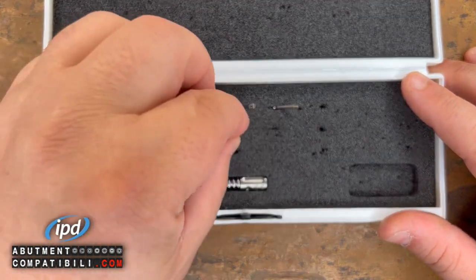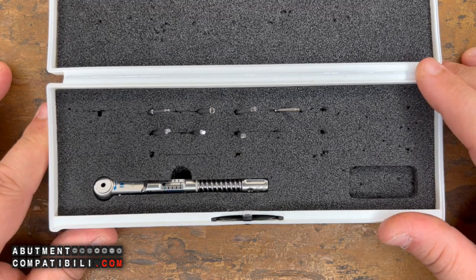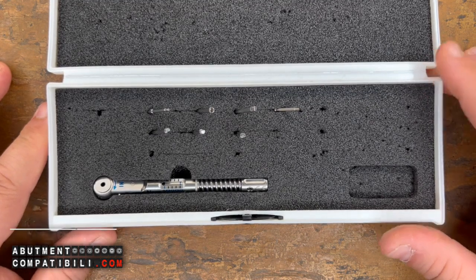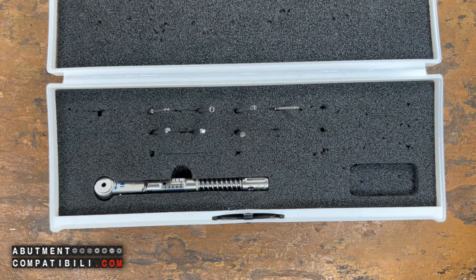We will have the opportunity to truly have an indispensable kit, especially for those patients who arrive with implants placed in other practices, rather than those placed in the clinic. So we don't even know which ratchet to use as a reference.